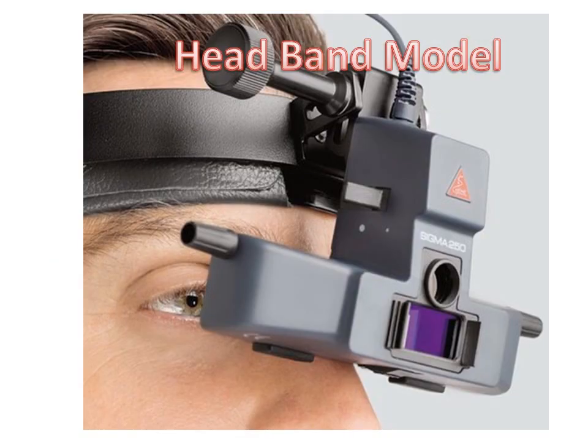This is the headband model which I have already shown you, and I have already told you the parts also. And one part which was missing in that particular diagram was a teaching mirror.